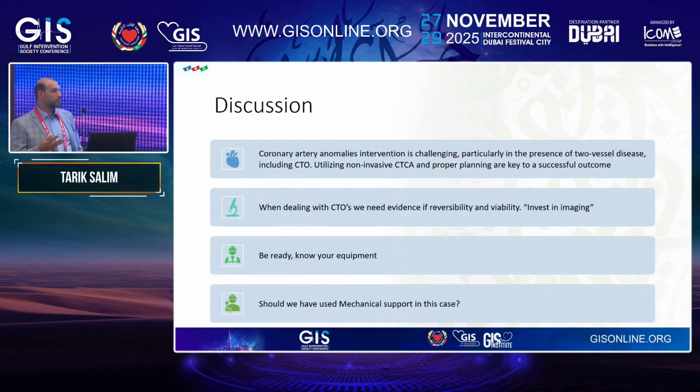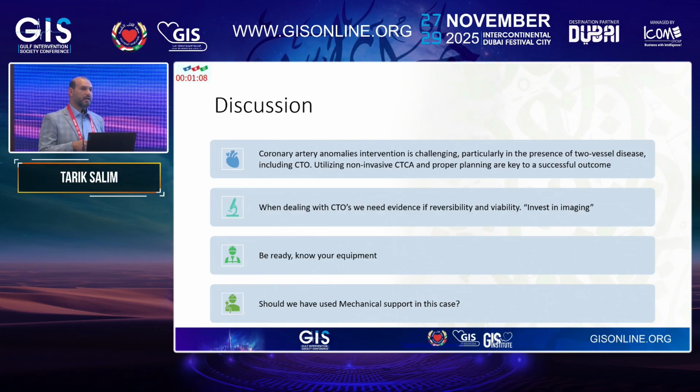I'm more than happy to discuss, because this lady, despite having normal LV function, obviously the main worry still was the left main and the whole thing. So a big question regarding whether we should have used mechanical support or not. I'd like to hear and share voices and experience.